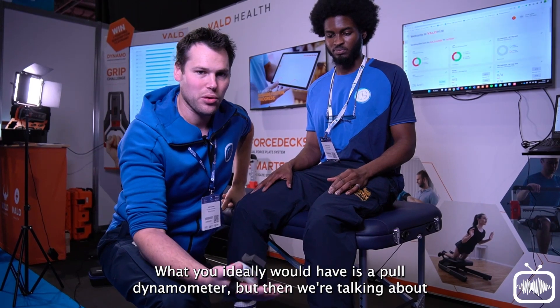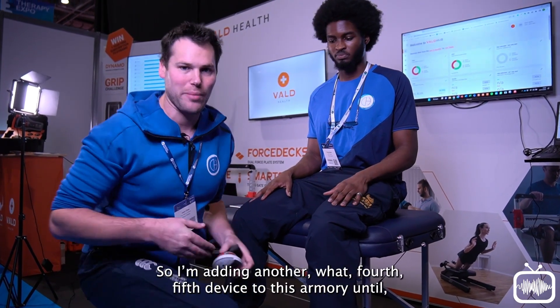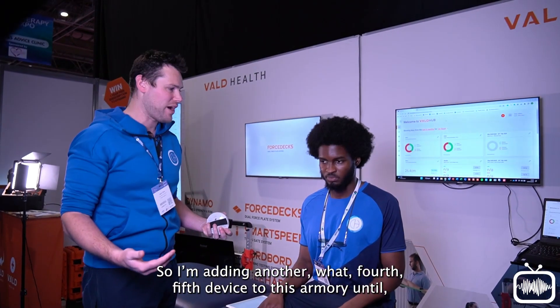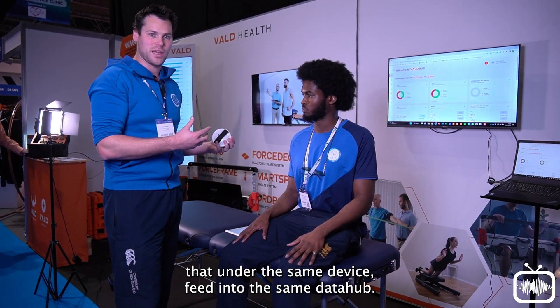What you ideally would have is a pull dynamometer, but then we're talking about getting another device — a crane gauge or something like that — adding a fourth or fifth device to the armory. Until, of course, our Dynamo can actually incorporate that under the same device and feed into the same data hub.